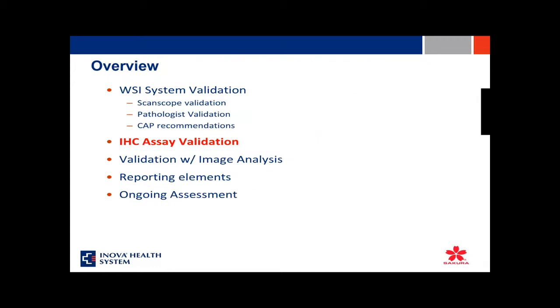We'll talk about IHC validation now. Now that we've validated our imaging system, we're going to talk about our IHC validation here. Again, there are some general guidelines for any assay, for any test validation. I think the first one is to use your manufacturer's instructions. Know your test materials. Your test materials should be similar to your patient samples. And again, you have to provide complete documentation of your results, including your procedure, and your laboratory director must approve these results before you place it into clinical service.